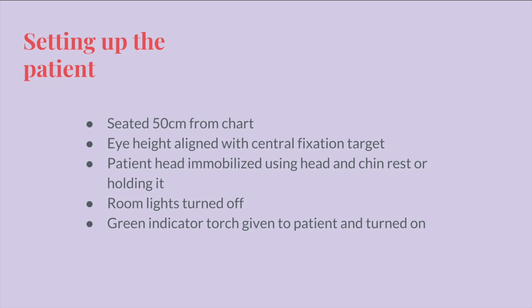The patient needs to be aligned with the central fixation target, and it needs to be explained that they need to keep their head very still and only follow the appearing lights with their eyes, not with head movement. As we had a very cooperative patient, holding her head still was not necessary. However, if the patient had a tendency to adjust their head position, holding their head in a stable position would be necessary. Ideally, you would use a headrest and a chin rest to ensure that the patient remains still. However, this was not available to us on the day.